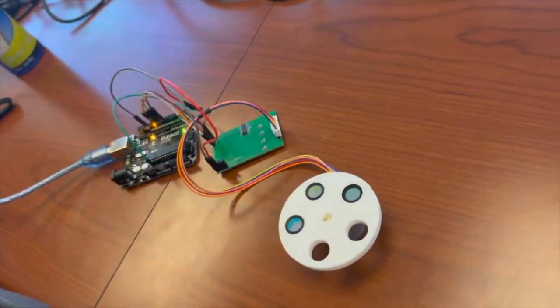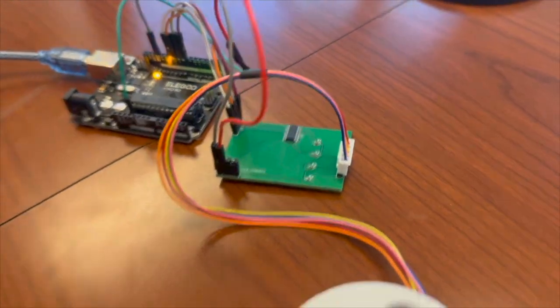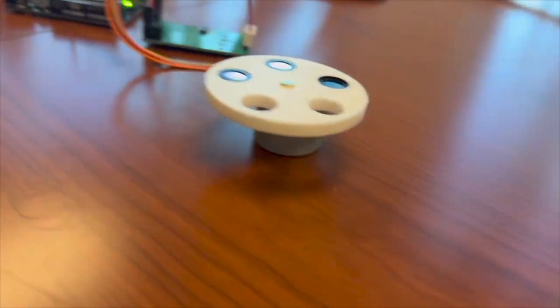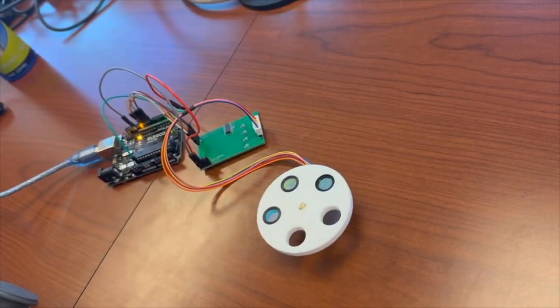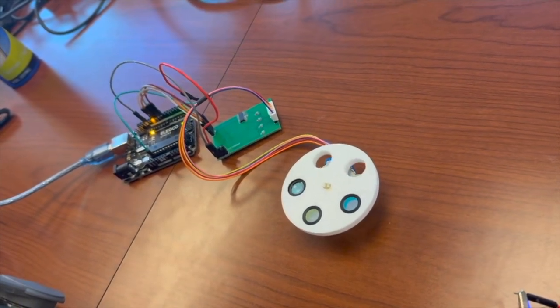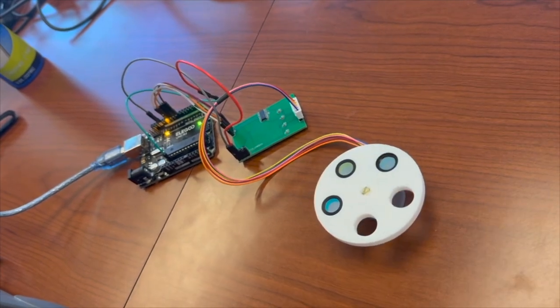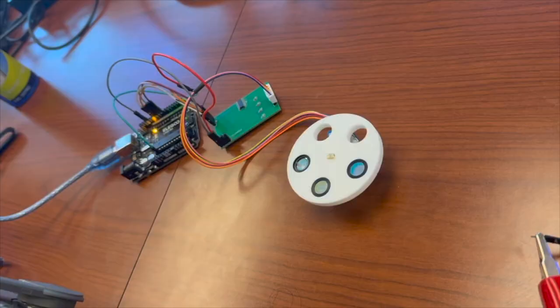This is the stepper motor driver board. It utilizes the ULN2003 driver and 4 standard digital input-output pins for control. Due to the unique pin layout of this board and the absence of jumper cable, the motor board is activated using a separate generic Arduino for demonstration purposes. This allows precise rotational control without hardware modifications.